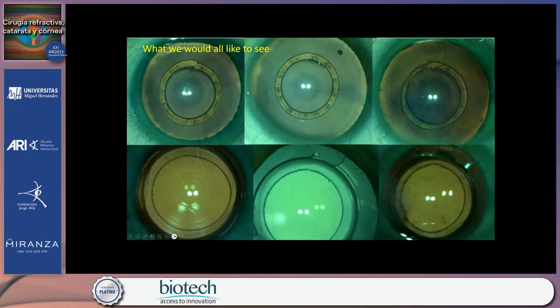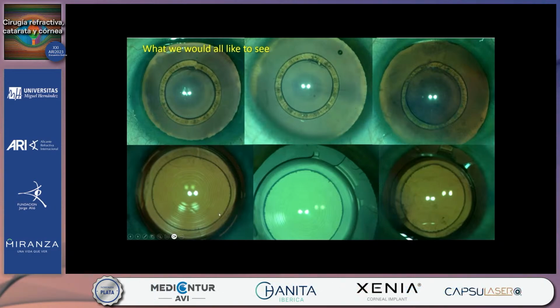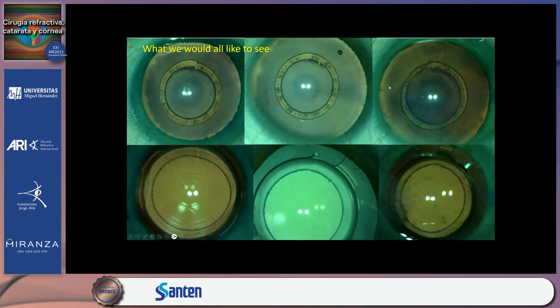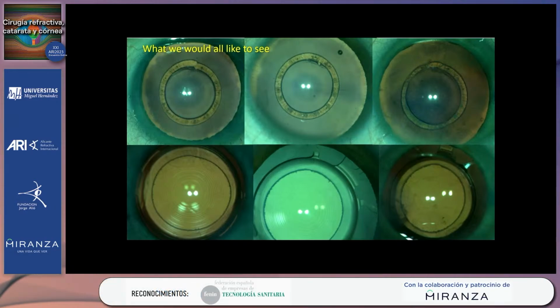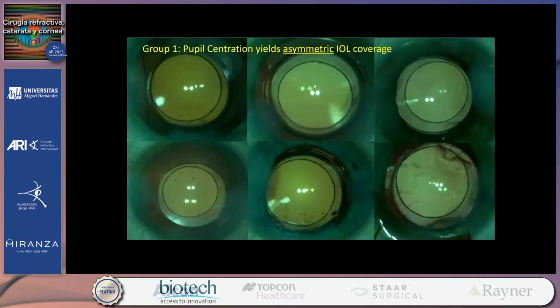What we'd like to see, of course, is a nice capsulotomy centered on your Purkinje image or your Trypan landmark or on the pupil, and all yielding a nice IOL centered on the capsulotomy. In the study, we had a small number, about 5% of eyes, that actually achieved all 3 criteria. So there are obviously some very symmetric eyes out there, but it's not every eye. And I think we need to look beyond the 5%, at the 95%.